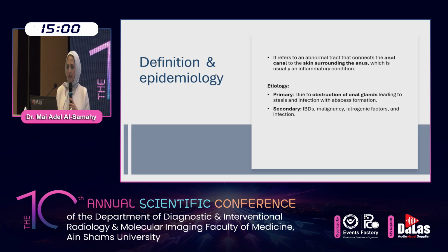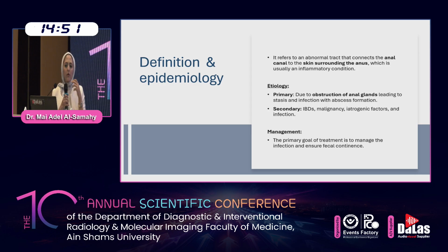So, what is our role as radiologists? Our role is actually not to diagnose the presence of a fistula, because most fistulas are already clinically confirmed. Our role as radiologists is to provide a roadmap for the surgeon, a roadmap for a proper intervention to allow decreasing the recurrence rates and as well preserve the fecal continence for the patient, which is a very important matter.